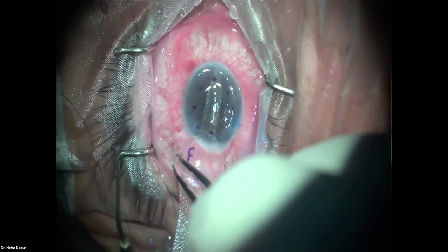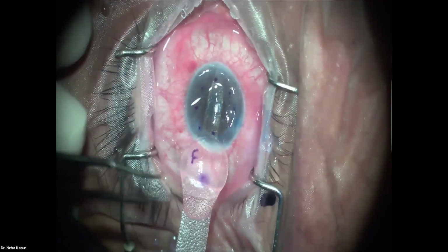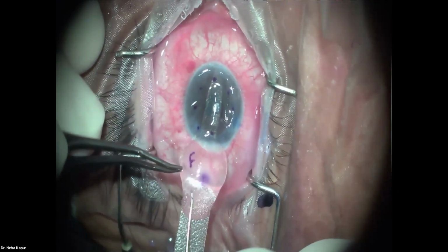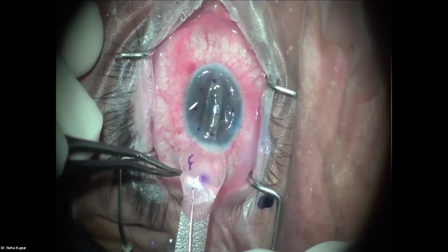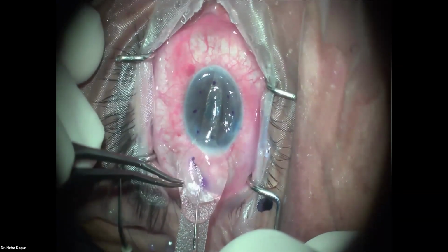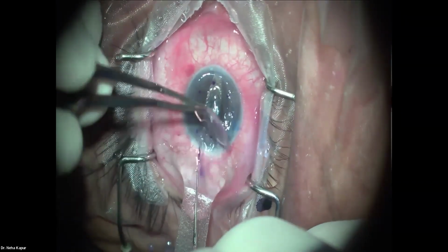Place the tissue in such a way that you have the endothelium resting down. Find a plane of insertion in the interface. And peel off the cap.